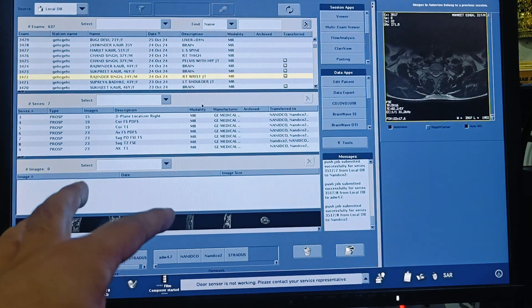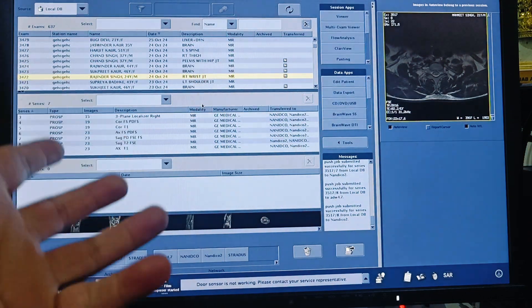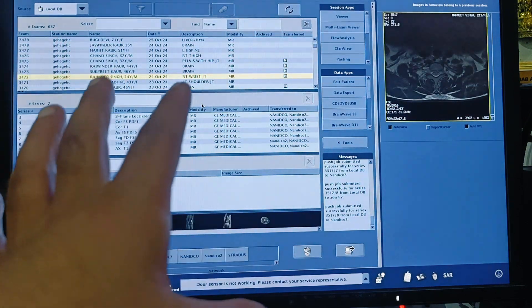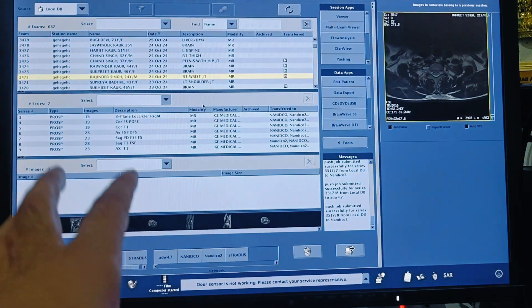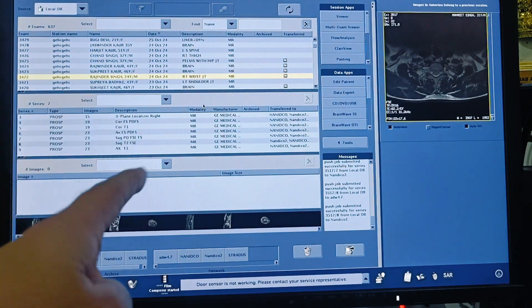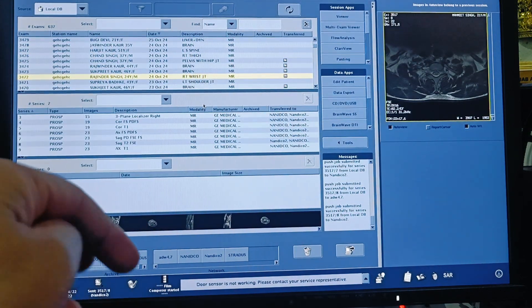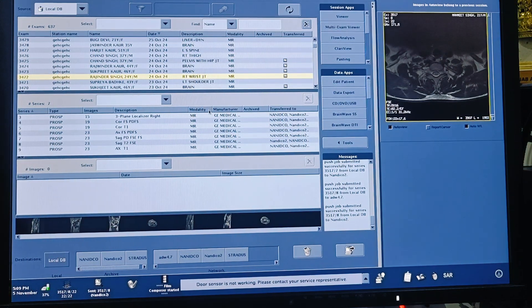After achieving the proper position, you will center the laser beam localizer over the wrist joint and your position will be absolutely correct. The most important thing to remember before beginning the scan is that patient positioning is very mandatory. MRI position of the wrist is very important.